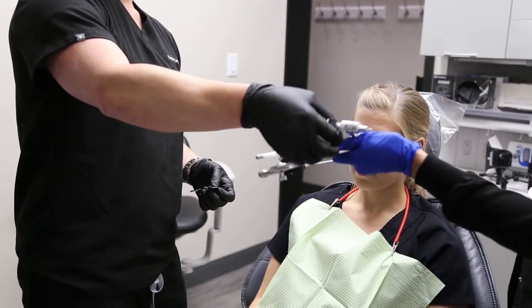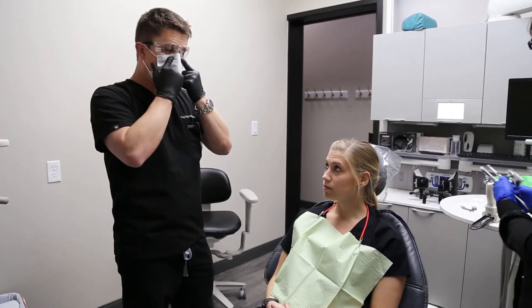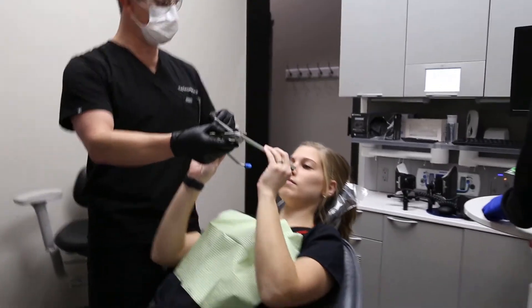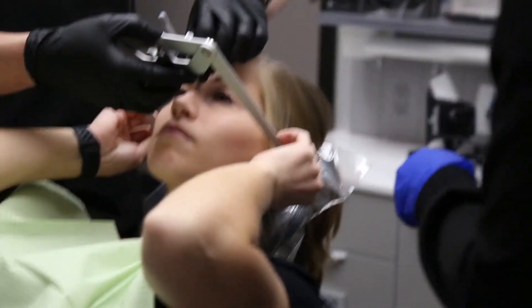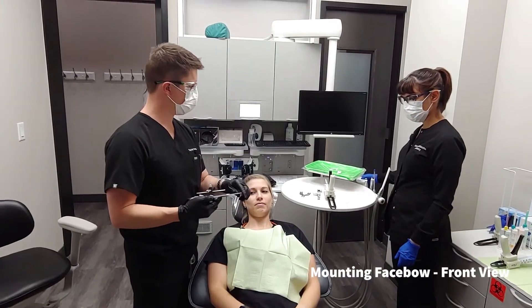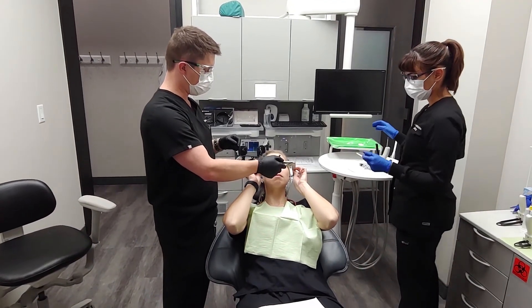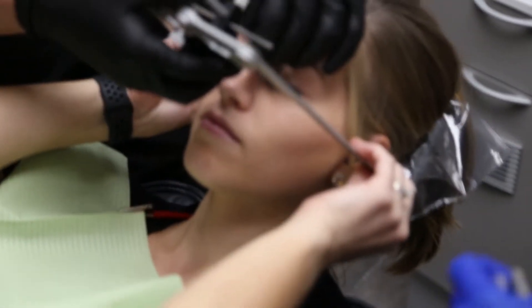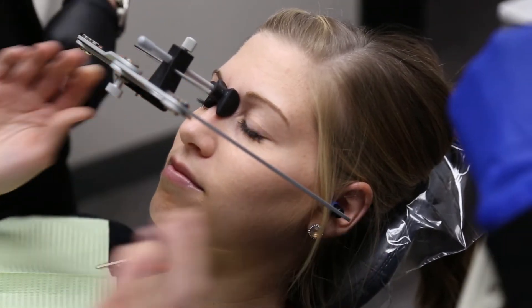I'm going to put my mask on and we'll begin by putting the transfer bow on the patient. I usually ask the patient to help insert the blue tabs in their ear, placing them as snugly as possible — as far forward and up in the ear as possible without being uncomfortable. We'll then use the nasion relator and tighten it to allow her to let go of the transfer assembly.